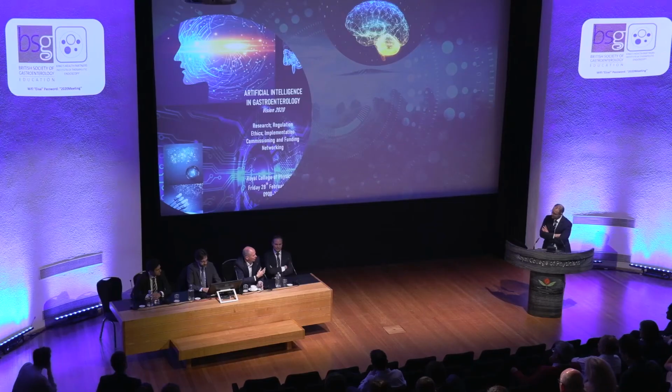Yeah. Quality in colonoscopy will still matter, so you need a clean colon, you need to withdraw slowly, and you really have to expose the mucosa. And then all the systems have shown that polyps can be detected. However, you also see that the borders of the lesions are sometimes a little bit more difficult. And even if you have the diagnosis, then you have to make the decision whether you do an endoscopic resection right away or you send to surgery and so on. And these will be the learning tasks for the future, because for the other things, if you really go for quality colonoscopy with these systems, I think that even somebody who's not so well trained will see almost all polyps with the help of the machine.